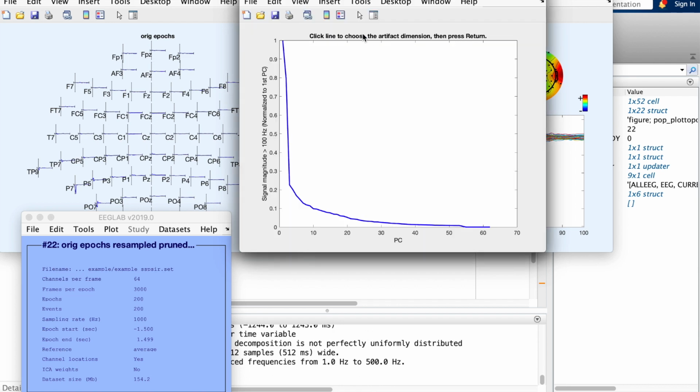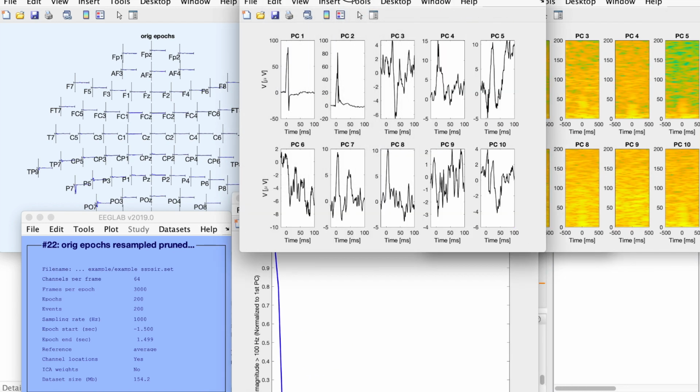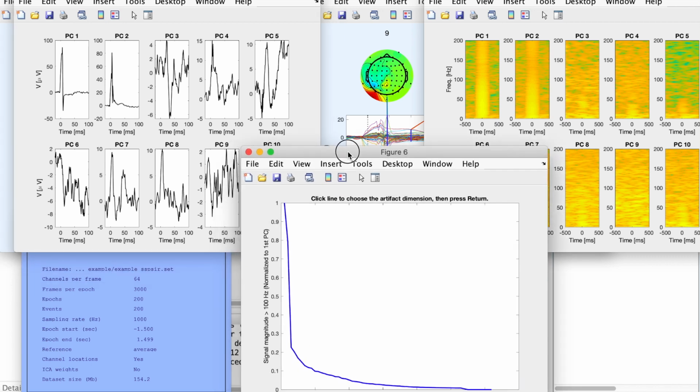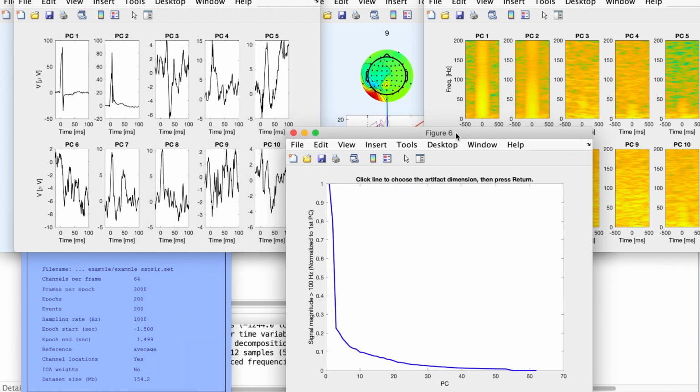Before we have the final result, we need to decide how many muscle artifact components we are removing. And the SSP-SIR function will give us 3 figures from which we can determine this. And here I think all the figures tell the same story. So I would remove 2 components because the first 2 components have this clear broadband response that I talked about being characteristic of muscle artifacts. And similarly, these first 2 components have these sharp initial responses. From the third figure, we can see that the first 2 components explain by far the most power of the artifact signal.